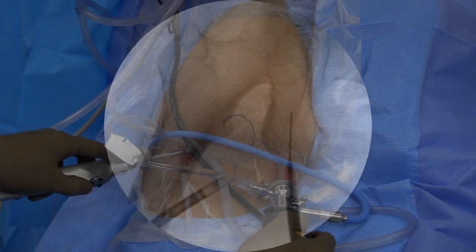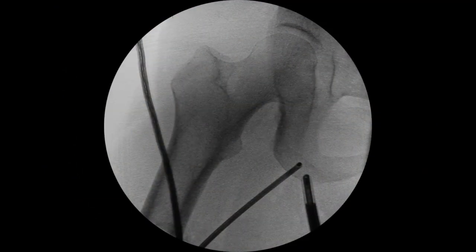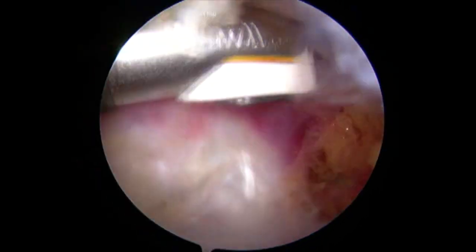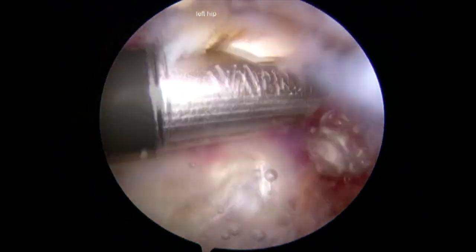Fluoroscopic images were used to localize the portals to the ischial tuberosity, signifying the origin of the conjoint tendon. A 30-degree scope was then introduced in the medial portal. Ischial bursa was seen with notable bursitis surrounding the ischial tuberosity. Location of the shaver was confirmed with fluoroscopy to avoid neurovascular injury, and the shaver was used to perform an ischial bursectomy. Adhesions were then removed to identify the origin of the conjoint tendon.